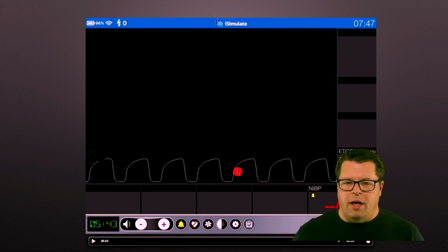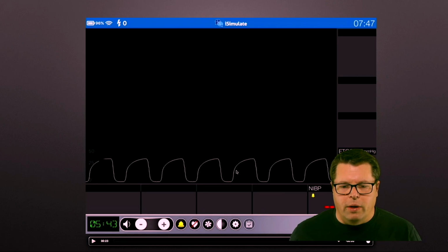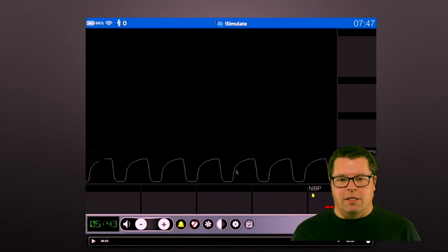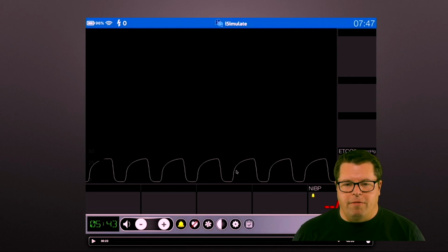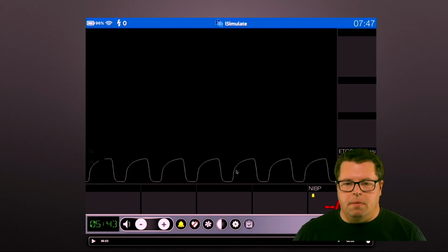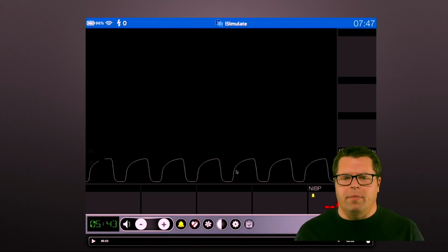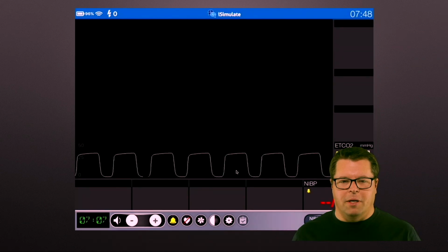What would cause you to have a slower expiratory volume and not get CO2 out to the detector quite as fast? Well, obstructive lung disease. The thing that makes you exhale slower, asthma, COPD, the thing that makes you, instead of breathing out fast, go through little constricted small airways. This is the classic shark fin, and this is a sign of obstructive lung disease, COPD, asthma, those guys.